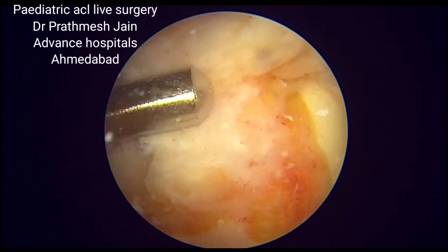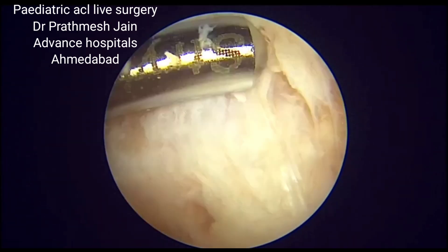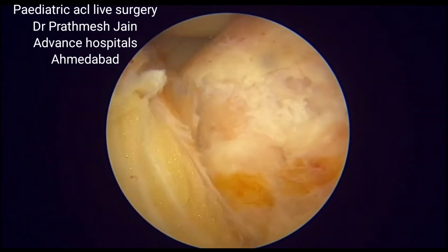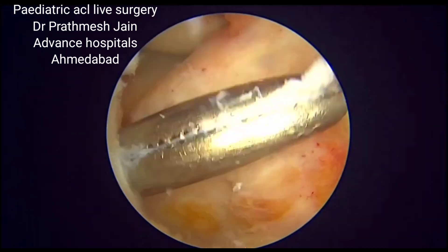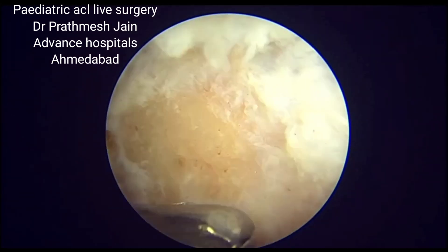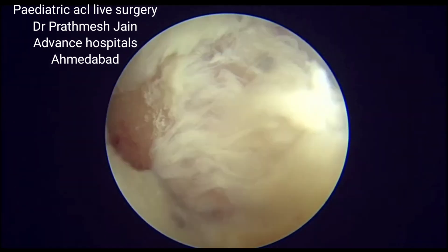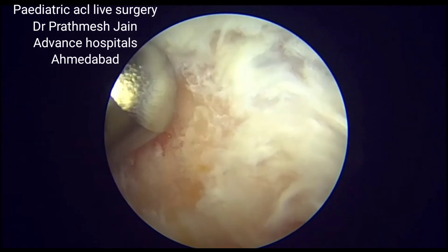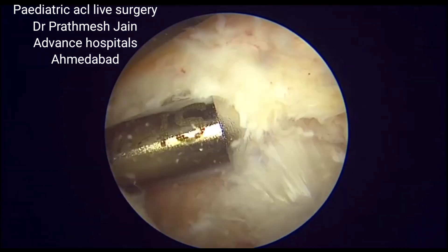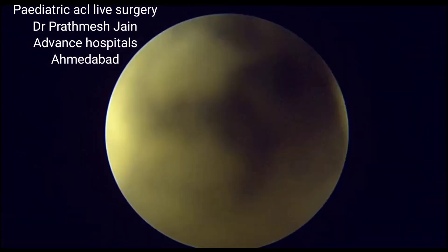This graft is positioned just anterior to the ACL footprint or ACL stump. Compared to any other technique, in this technique the chances of physeal disruption are practically zero. We dilate the area anterior to the ACL using artery forceps, making it easier to pass the tendon graft anteriorly into that region of the notch.